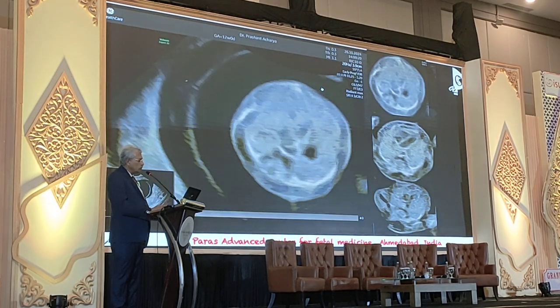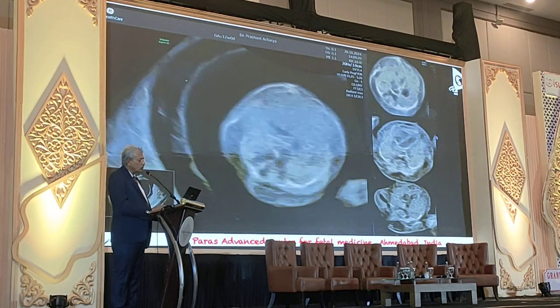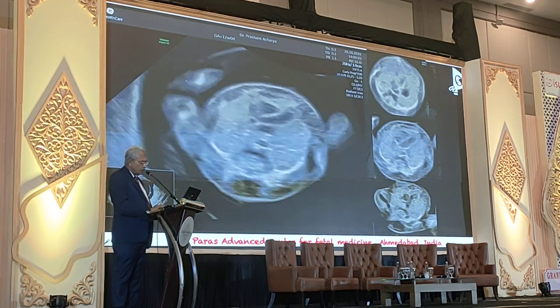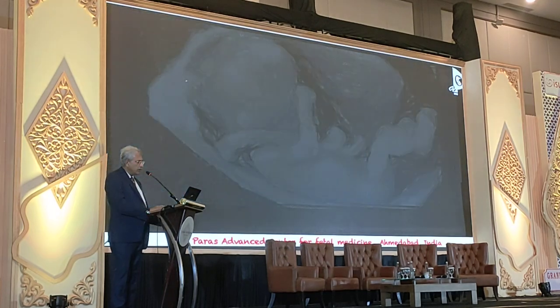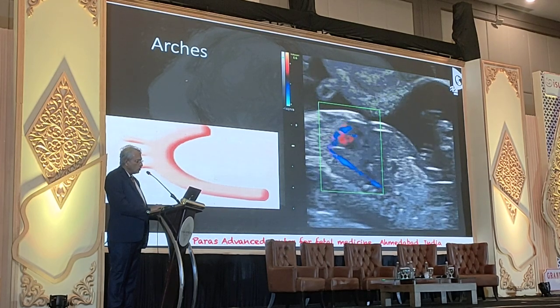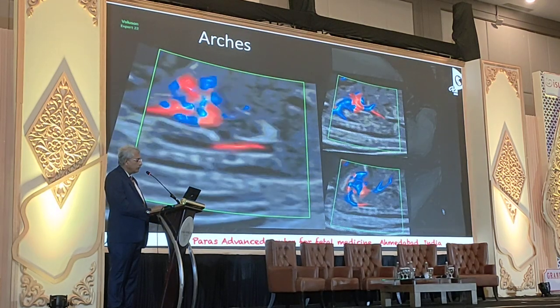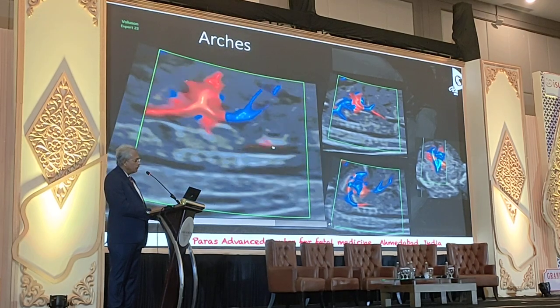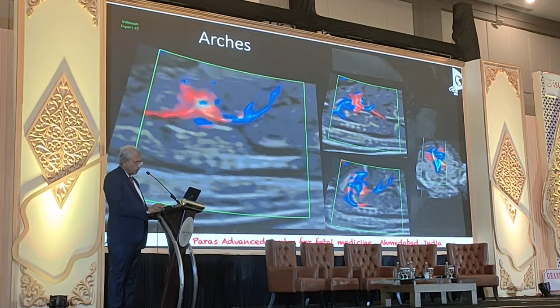Now a new machine, this is the new Expert 22 machine, but even in grayscale you can identify that the things are normal. 4-chamber view, outflow tracts which are fine, and 3 vessels forming a 3-vessel trachea view. So I'm practically not worried about those things. And for me, even the arch can be easily visualized, and both the arches can be seen. Not only that, the moment I use my slow flow, I think I'll be able to identify those things far better, including the vena caval view, the bicaval view also, which is seen. This is the venous system, this is the arch, this is the pulmonary arch, 3-vessel trachea view formation.